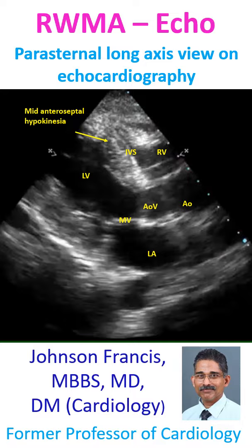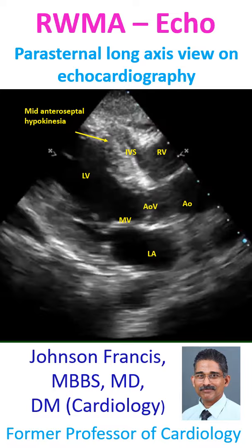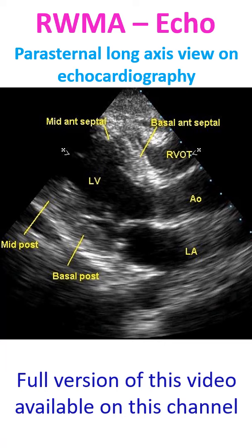Regional wall motion abnormality in the form of mid-inferoseptal hypokinesia is also seen. Myocardial segments seen on parasternal long axis view are basal posterior, mid-posterior, basal inferoseptal, and mid-inferoseptal.